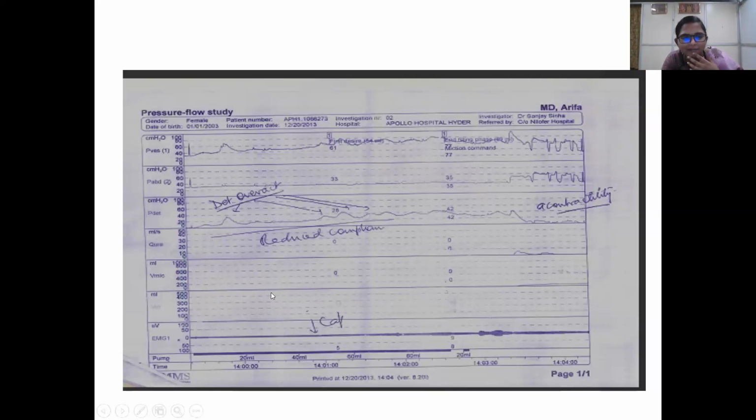Which is the graph for capacity, sir? Capacity. If you look at the last line below, where it's written 20, 40, 60, 80, can you see that? The last line at the bottom, below EMG. Okay, 20, 40, 60, 80. So it's about 100 ml. It will also be in the volume infused line if it's there. Volume infused is the second last above the EMG. It should be there, but because of this printing it's very faint. It's not a very good quality photograph, so it's not being seen.